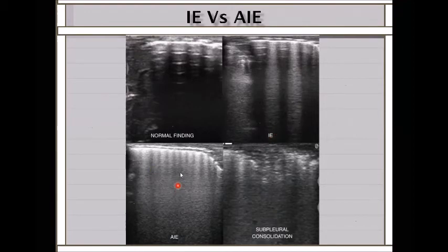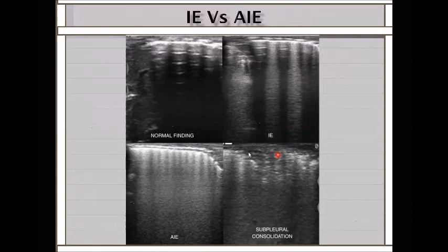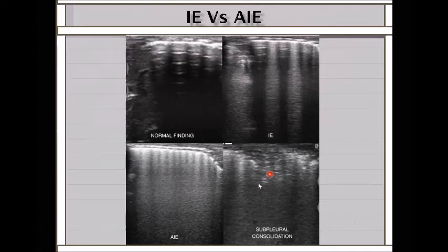This is normal lung: A lines present, B lines do not reach the end. This is abnormal: fewer A lines, B lines reach to the end—interstitial edema. Here both interstitium and alveoli are filled with fluid—the air and interstitium are edematous or collapsed. Air bronchogram seen: loculated, somewhat oblique, not identical like A lines. This is consolidation. If the baby has fever and high white cell count, this is pneumonia. Sub-pleural consolidation is also visible.